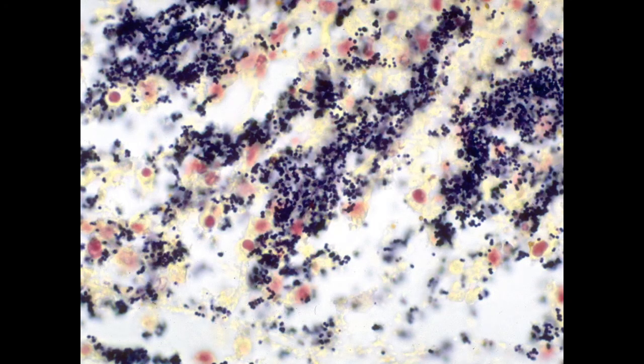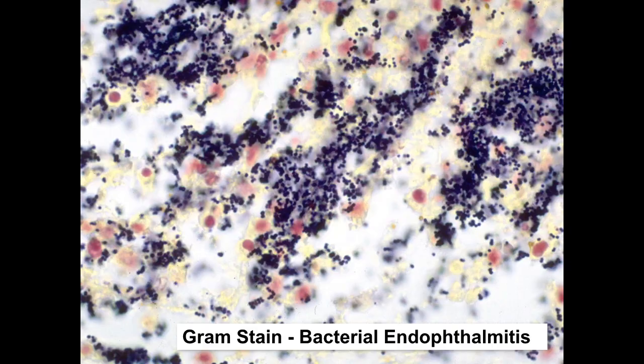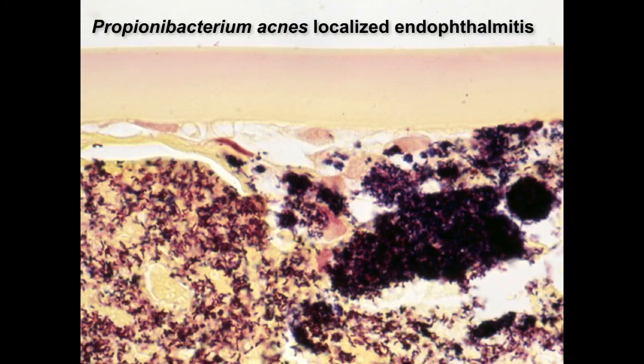This is a Gram stain showing gram-positive bacteria in a case of endophthalmitis. This Gram stain shows colonies of P. acnes entrapped in the lens capsular bag in a patient with postoperative localized endophthalmitis.